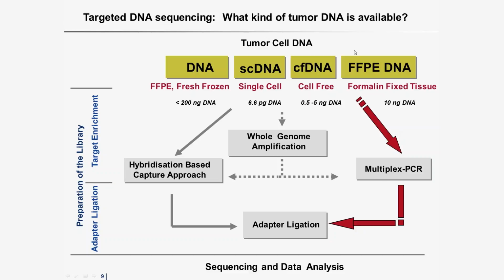In our department, we are using cell-free DNA and also DNA from formalin-fixed tissues, and therefore we are dealing with the multiplex PCR DNA enrichment.